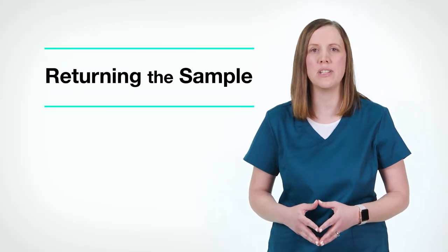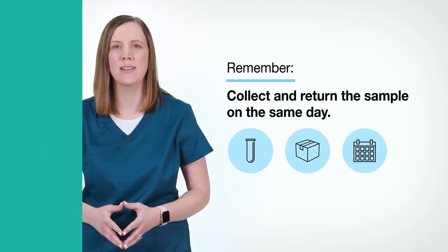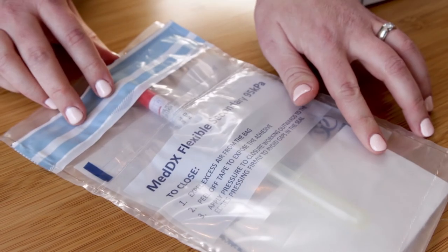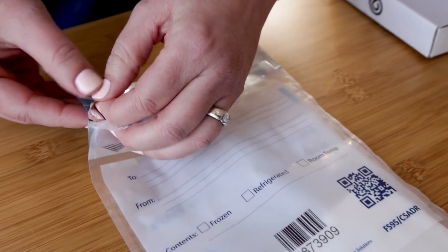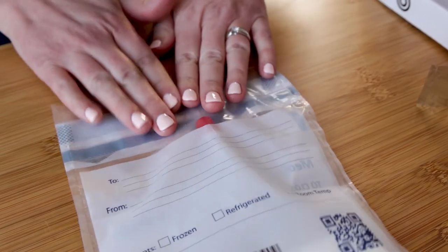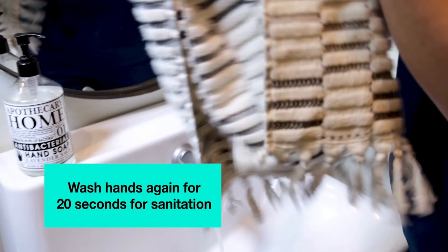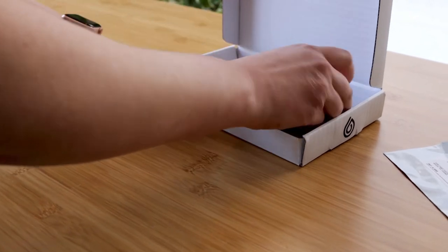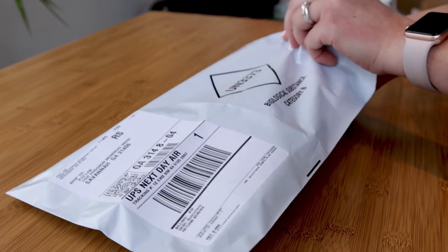Now let's show you how to properly prepare your sample for return to the laboratory for testing. As a reminder, collect and return the sample on the same day. Begin by placing the swab tube in the clear bag. Even though the swab sample is dry, please do not remove the absorbent pad. Seal the bag by tearing off the strip to expose the adhesive, then fold the top of the bag over. After collecting your sample, remember to wash your hands again with soap and water for 20 seconds. Once your hands are dry, place the sealed sample bag in the cardboard shipping box and close it shut. Then place the cardboard shipping box inside the large shipping bag and seal tightly.